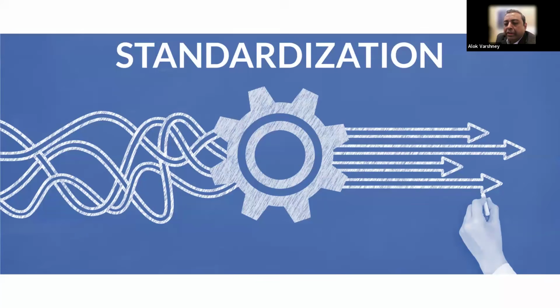So why did NT scan become so successful? Because Professor Nicolaides spent a lot of time standardizing the test. Before NT scan, everybody used to do ultrasound in their own different way, so naturally the results would not tally everywhere. But he made sure that we have to acquire a certain image with certain parameters, and that led to standardization, and that led to good results.